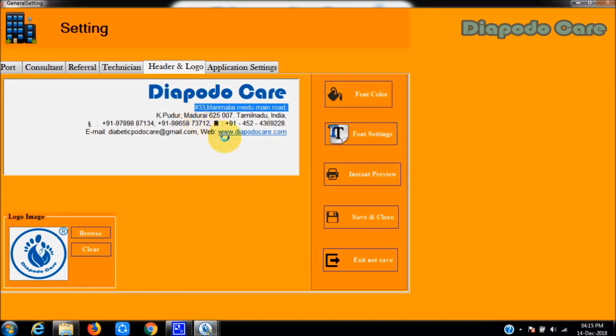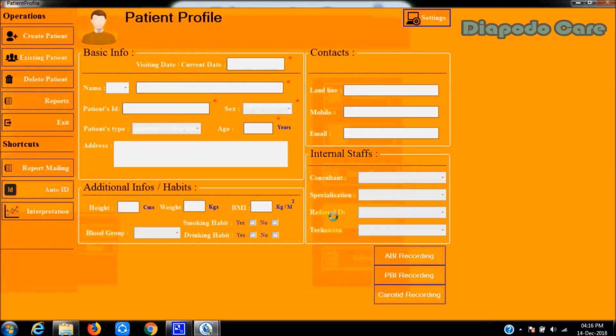In the report header and logo section, the user must select the save and close option to save any modifications that have been made.